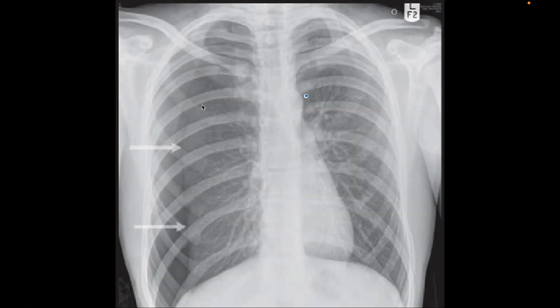In this case, you can see the border of the parietal pleura here and the chest wall here. The space between them is filled by air, and we have a pneumothorax in this case too.